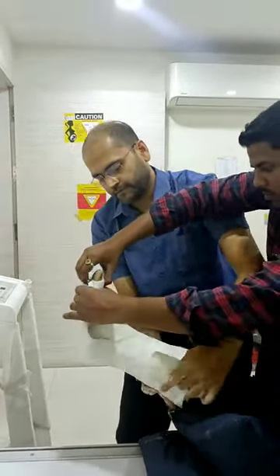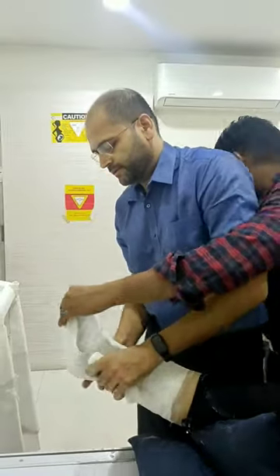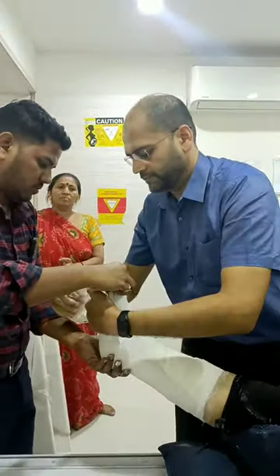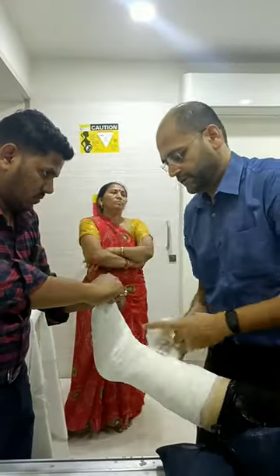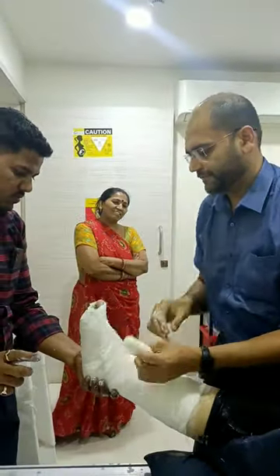Various materials have been used to immobilize limbs since antiquity. Use of plaster of Paris for this purpose started since the mid 19th century. Plaster of Paris is a hydrated form of calcium sulphate which is derived by heating gypsum. When it is mixed with water while applying plaster, it gives out heat and quickly sets to a hard porous mass within 5 to 15 minutes.